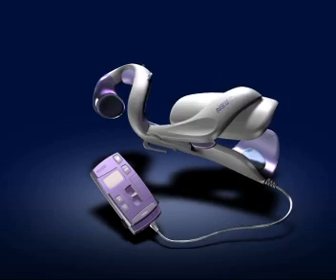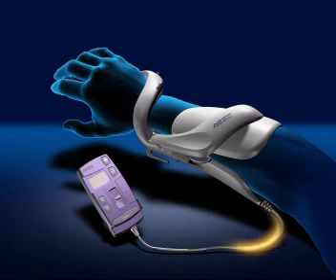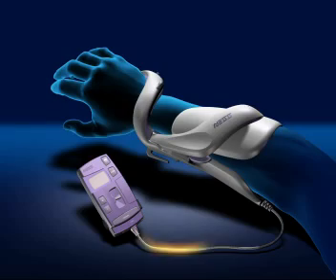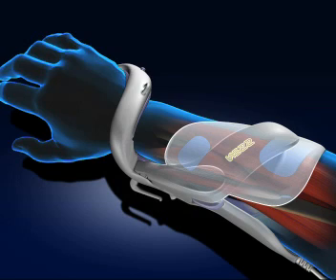The Ness H200 consists of an electronic orthosis and its control unit. The control unit transmits synchronized electrical pulses to the peripheral nerves through electrodes built into the orthosis. These pulses accurately and consistently activate five muscle groups of the forearm and hand.